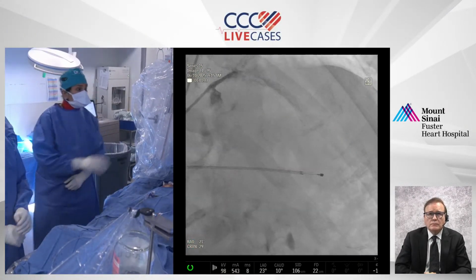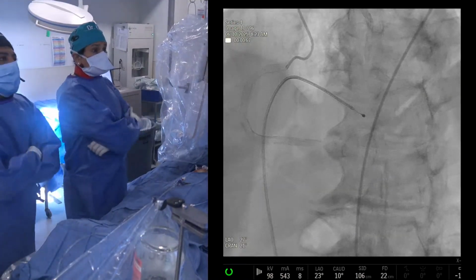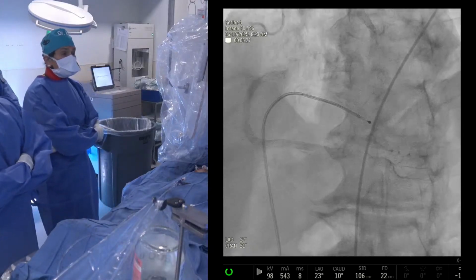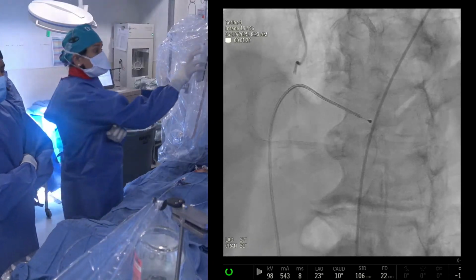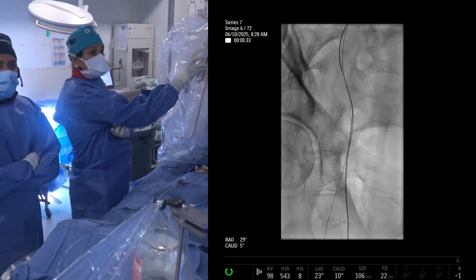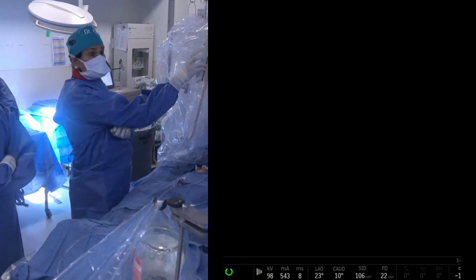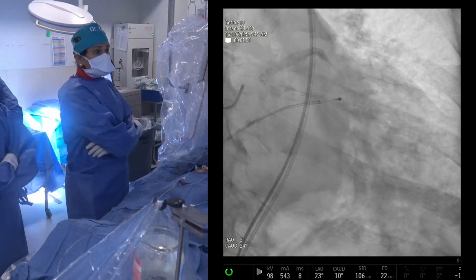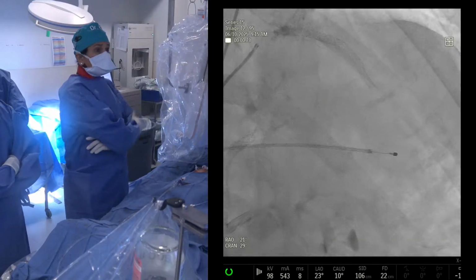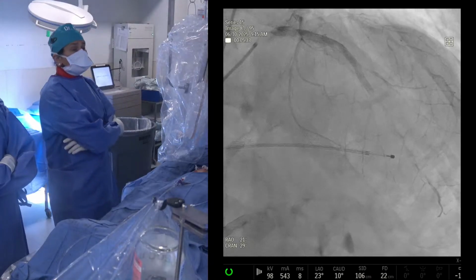Oh, no, only because of, let me show you, go back to, look at this. This was a heavily calcified RCA requiring rota and multiple stents. And then we just did the left side. You saw it. Yeah, this is it. Yeah, no, look at this. There's a circumflex stent, LAD stent. Three vessel, yeah. Rota? And all this is done.